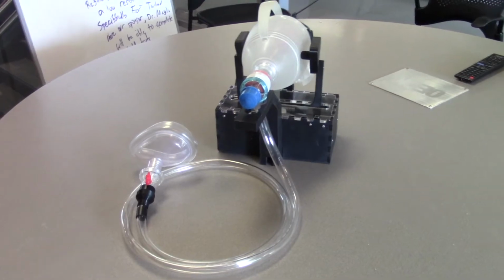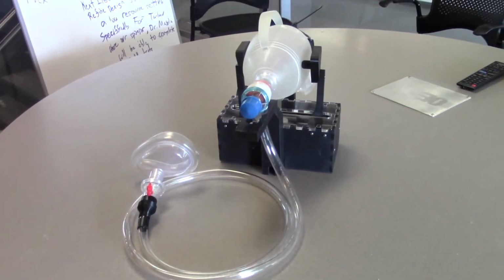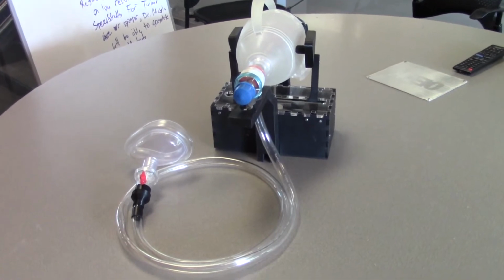When designing the device, there were several criteria we had to consider. First, we wanted it to be low cost, since this is for low-resource settings. We also wanted good control of the breaths per minute and the volume provided, so that we can provide sufficient ventilation. We also wanted to limit the size and weight of the device so that it can be portable. Additionally, the device needs to last for a long time, so it can be a proper replacement for the ventilator. And finally, we wanted to limit power usage, since power may not always be available. So this is our device, the automated bag valve mask. And now we will go through how the device works.